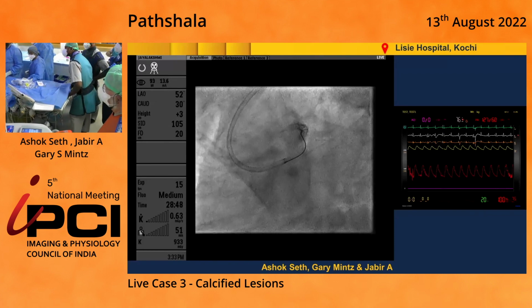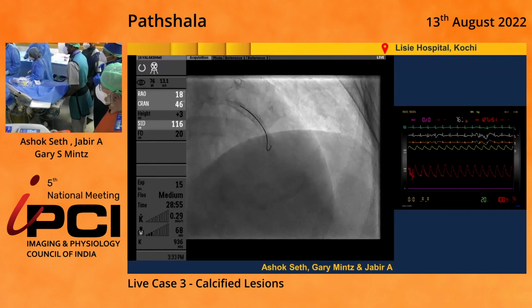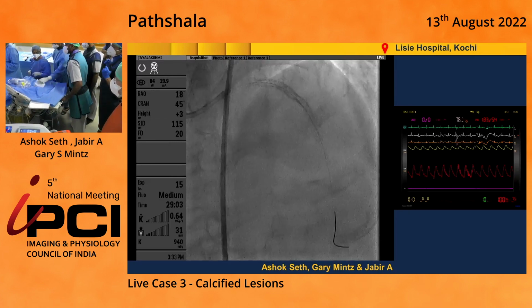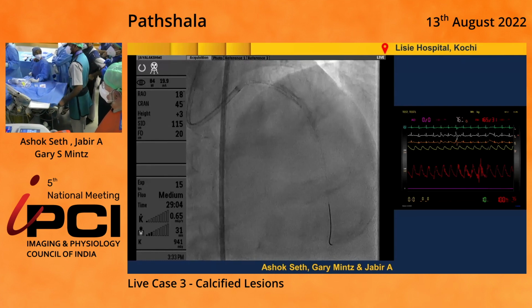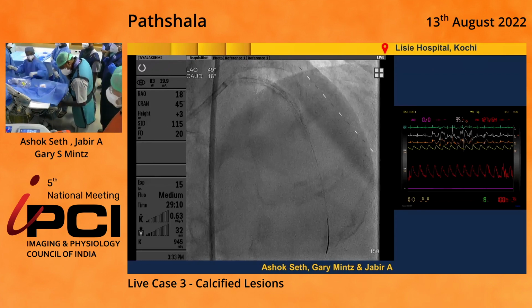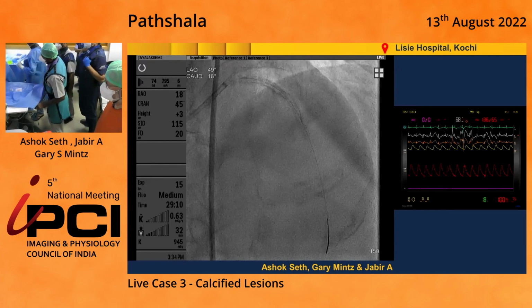The honest answer is I don't know. What we know is that shockwave can be effective at fracturing calcification, even with a freshly deployed stent. The amount of damage caused to the polymer in an Abbott stent is 6%, Medtronic is 7%. You get no damage in a Boston Scientific stent because there's no polymer on the luminal surface. On balance, if you have an underexpanded stent and have to damage 6% of the polymer, it's probably worth it. Lesion prep before is better, but if you have a bailout, IVL should be safe and effective.